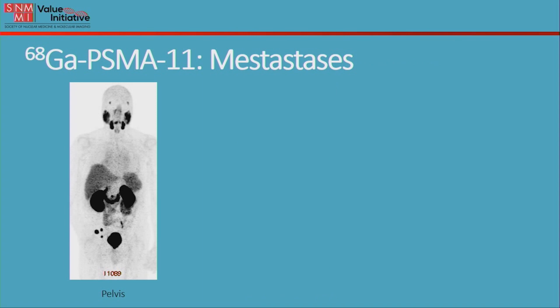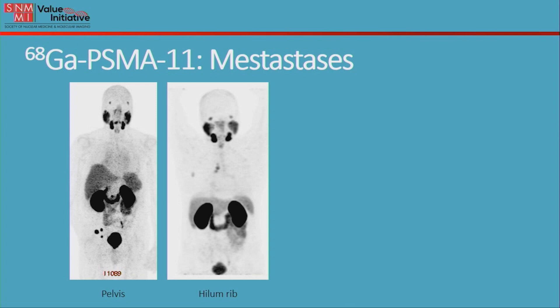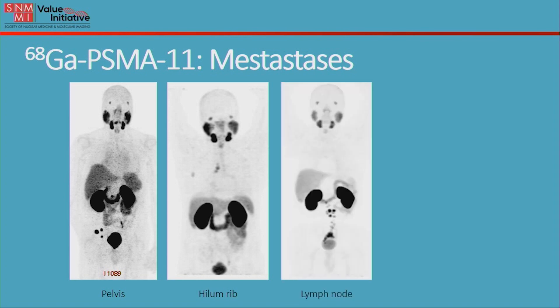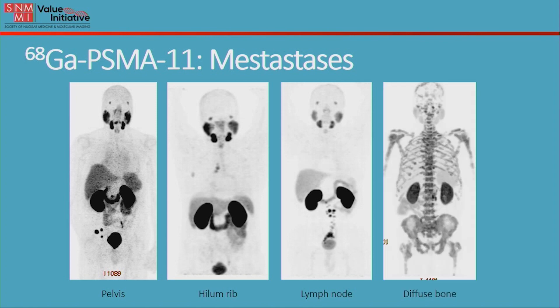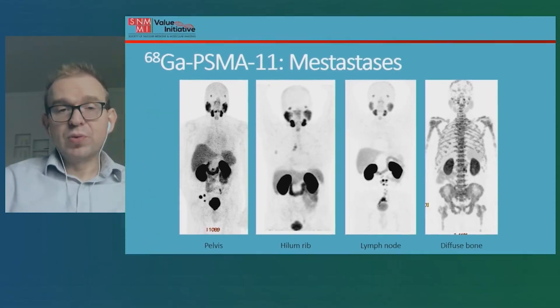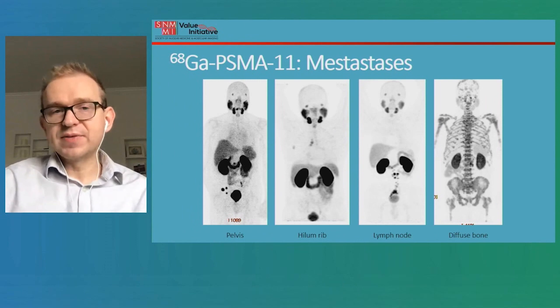Now let's look at what it looks like when patients have spread outside the prostate. In the first image on the left, there are three additional spots in the region of the pelvis, indicating metastatic deposits. In another patient, there are sites of uptake in the chest — lesions in the bone and lymph nodes. Another patient shows multiple lymph nodes with increased uptake in the pelvis and abdomen. Finally, on the right side, is a patient with diffuse spread to their bones, showing increased uptake throughout their skeleton — examples of positive scans that have isolated sites of metastatic disease.